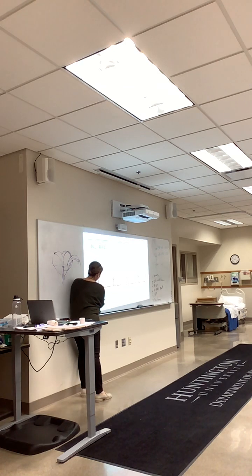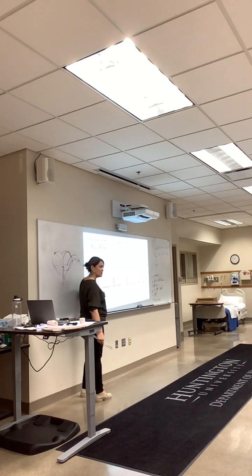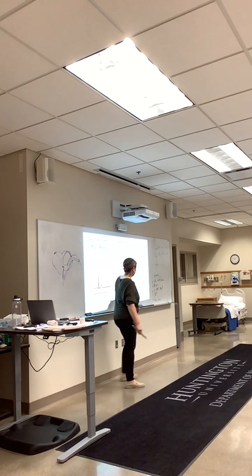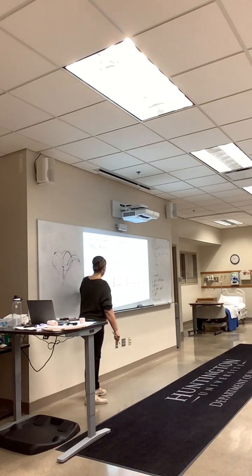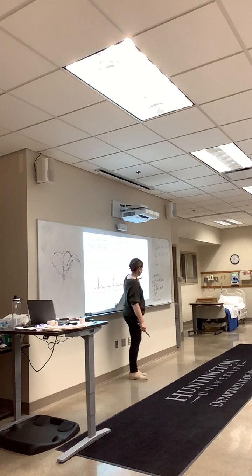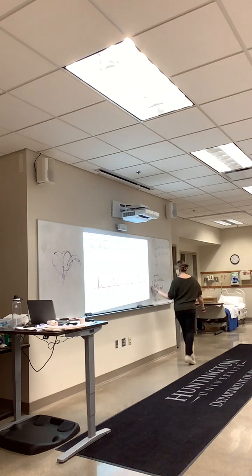I'm gonna look at my PR interval. I'm gonna rate my PR interval right here. Okay, we are less than 5 boxes. I have 4.5 boxes, so I'm happy there. I'm gonna do my QRS measurement. Almost 2 boxes there, so that one's okay. So I have a narrow QRS. My PR interval's okay. I have a P wave present. For every P wave, I have a QRS, P wave QRS, P wave QRS, P wave QRS. So I like all of these things right here.